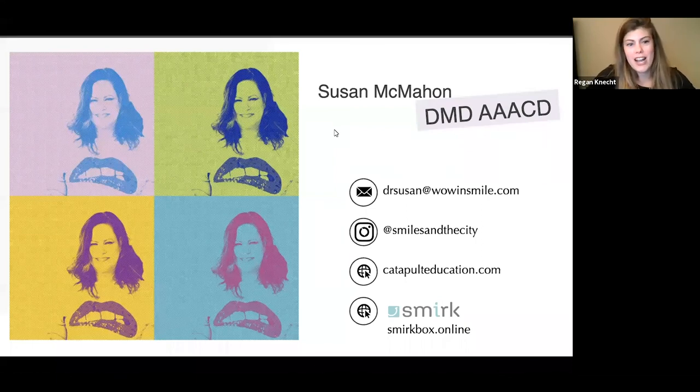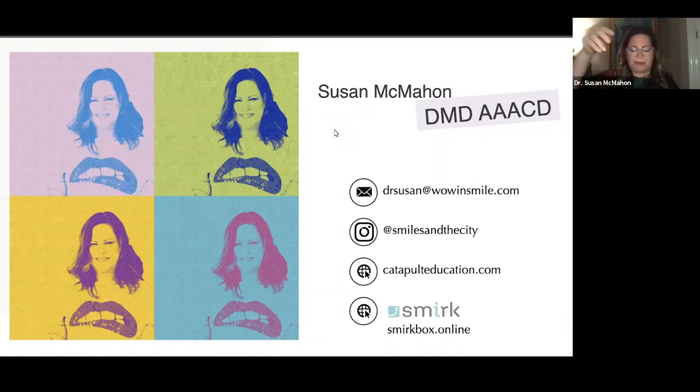Next question. What is the training process for your team on the iTero? So I remember very well when we first got the iTero, we had a Zoom where we put up a webcam on the iTero. We had everybody come in. We had one person sit in the chair. Everybody listened to the webinar or to the trainer, and one person scanned. We spent about 2 hours and got one person to scan. And it feels awkward. It feels clunky. It's hard to keep the scanner on the teeth when you're looking at the screen, because we're not used to doing that. You're kind of floating all over the mouth, and it takes forever to scan the first time.